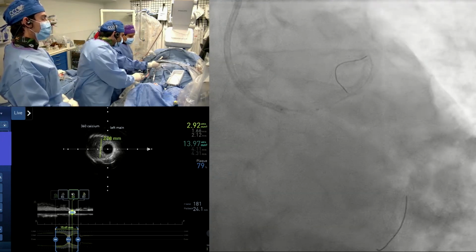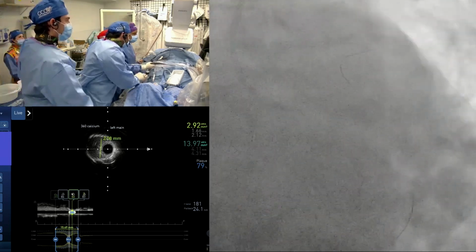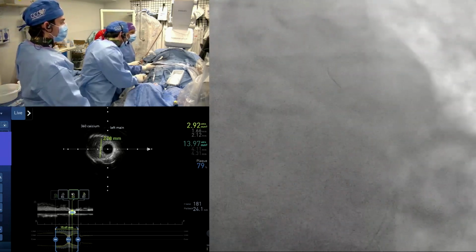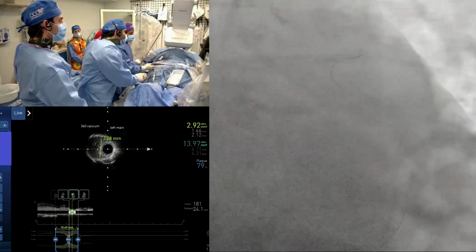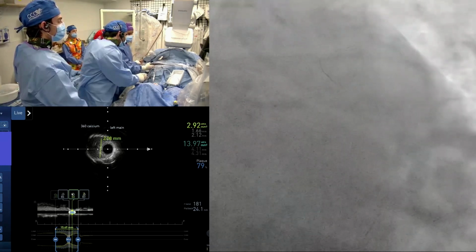So one thing that we also don't know is how much incremental benefit the IVL gives you over a regular NC balloon or cutting balloon or anything like that. I mean, we're actually doing a study, the Shortcut trial, in this setting post-rota. There's a stratification, IVL versus cutter. So we'll see.